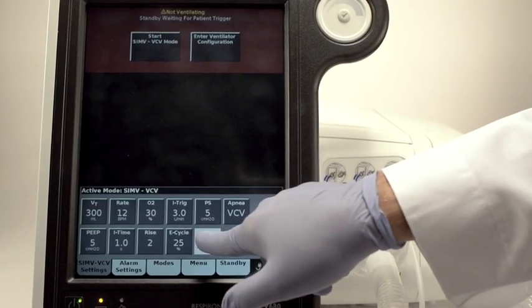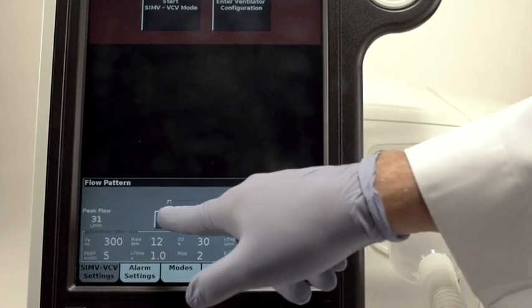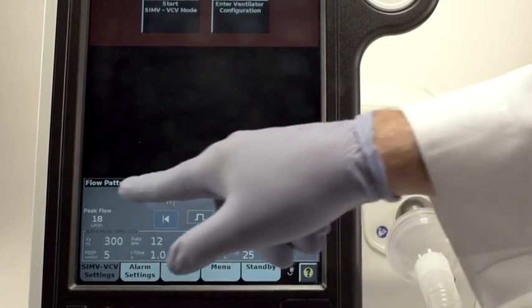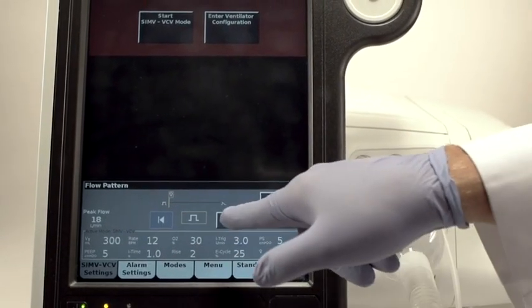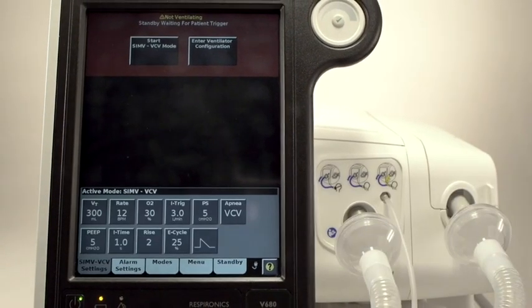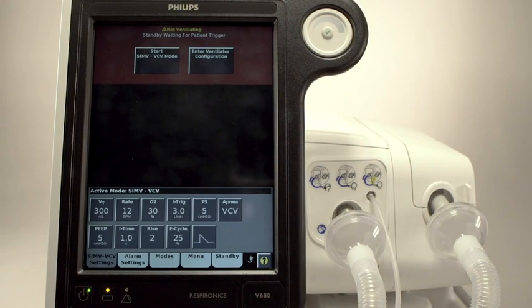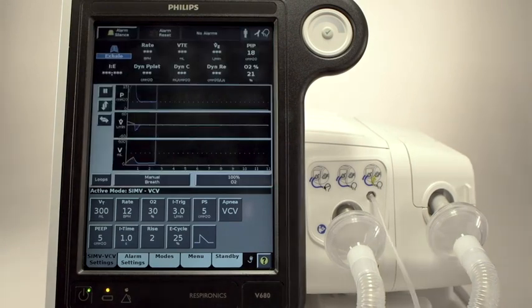The choice of flow delivery pattern will also affect the delivered peak flow. Note how the calculation changes as you change the pattern from square to ramp. Once you are satisfied with all of your settings, touch Accept. Connect your patient who was intubated while you switched to invasive ventilation and ventilation commences automatically.